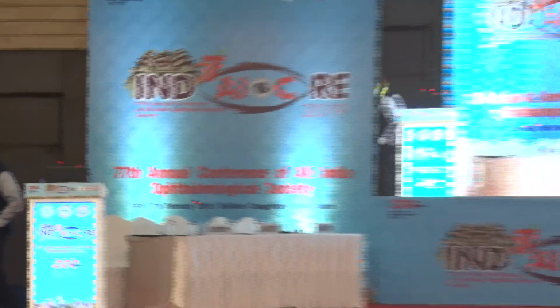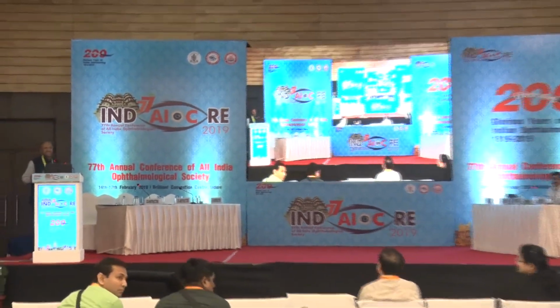Hello. Sir, in your view, which is a good Indian multifocal lens which gives more predictable result? You mean multifocal or trifocal? Multifocal. Truly, I believe that every multifocal works. The failure of a multifocal is not on the lens design. It is to do more with the error done by the surgeon in calculation, not surgical mistake. If you're off in your calculation, you have 0.5 or 1 refractive error post-operatively, you have a very unhappy patient.